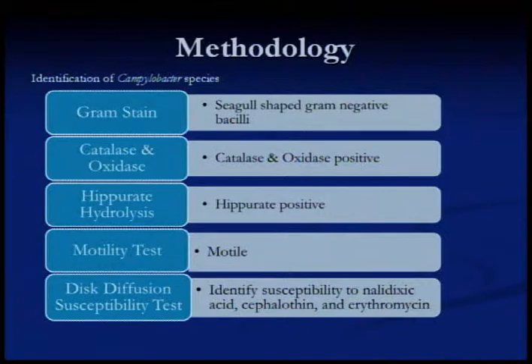For this, the bacteria was resistant if there was growth, and the bacteria was susceptible if there was a zone of inhibition. Any positive result by the EIA or culture was considered a true positive and directly compared with the immunochromatographic test. Therefore, the gold standard was twofold.